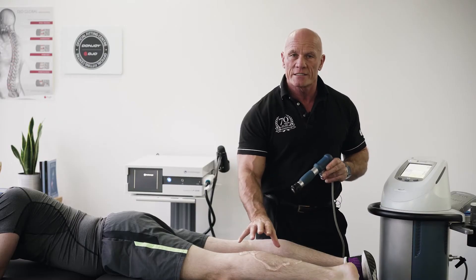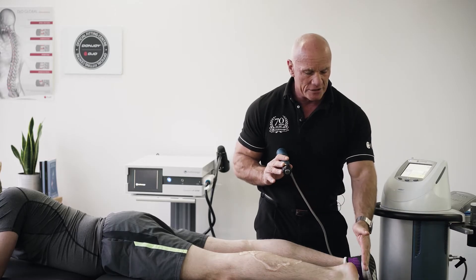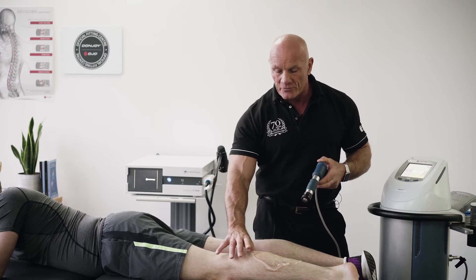Secondly, there's always an associated myofascial trigger point with a tendinopathy. In order to ensure the best possible outcomes, you must treat both areas. So if we're looking at pathologies such as plantar fasciitis or Achilles tendinopathies, we're going to find the trigger point in the calf muscle.